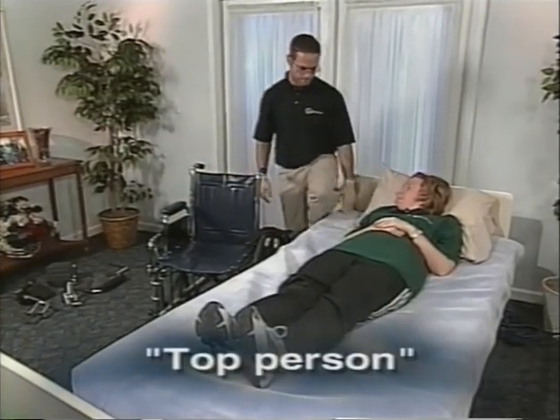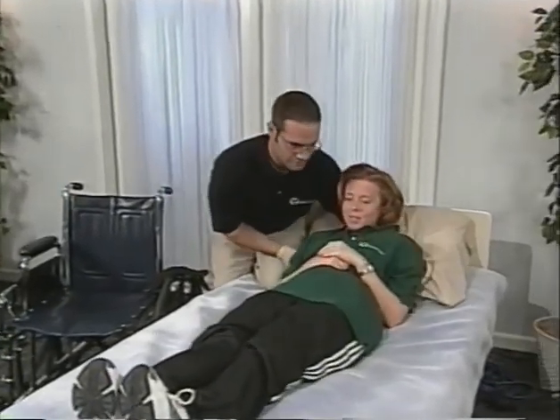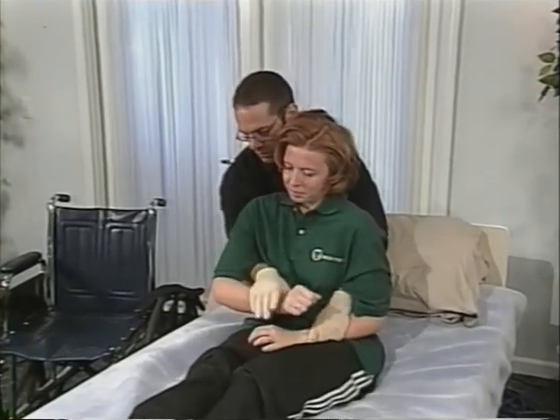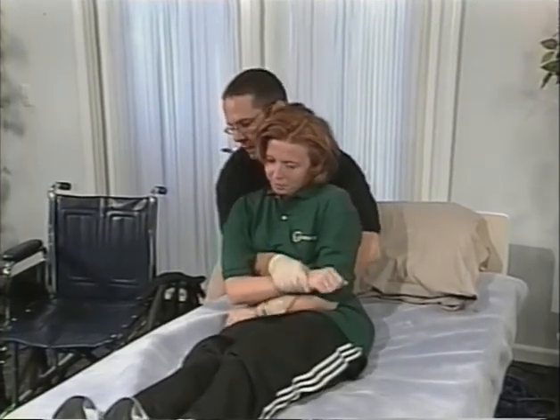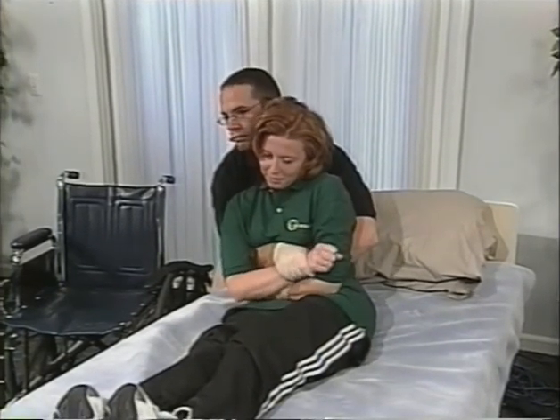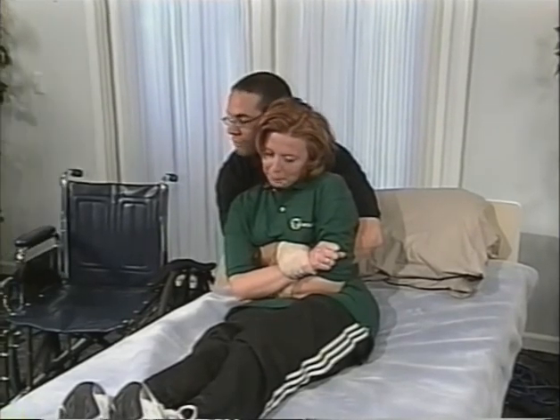We will now discuss and demonstrate proper positioning. Top person position. The top person sits the client up in bed. Place one leg on the bed edge and one leg in between the bed and the wheelchair. Position yourself behind the client and reach under their arms to grasp their forearms. Hold their forearms firmly to their chest and their body firmly to your body. Do not grab or lift the client from the armpits.